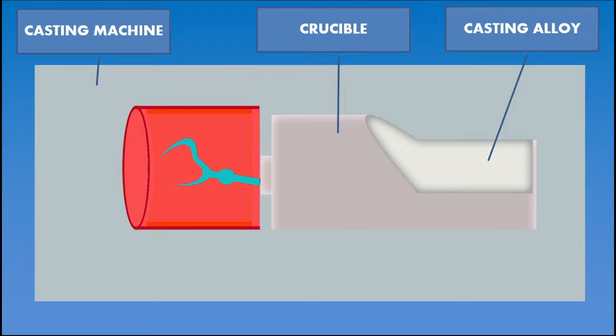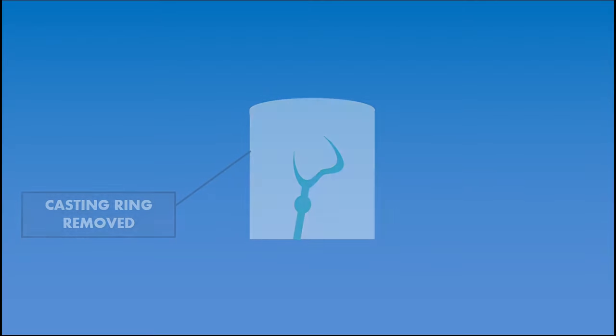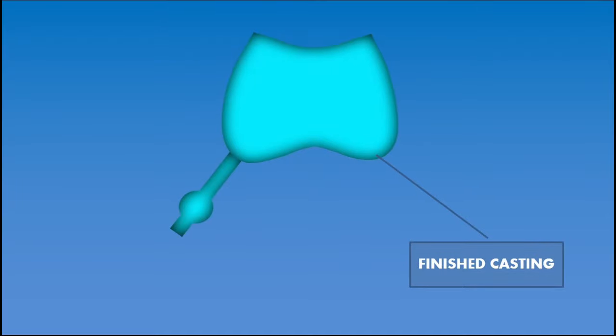After the completion of the casting, the entire setup is allowed to cool to room temperature. The casting ring is removed followed by retrieval of the casting from the investment. The attached sprue former is removed by sectioning and all the impurities, especially the investment which is present on the surface, must be cleaned. This can be done easily with the help of sandblasting. The retrieved casting is then finished and polished. The fit of the casting is verified in the die. Once it is perfect, it can be tried in the patient's mouth and cementation can be done.